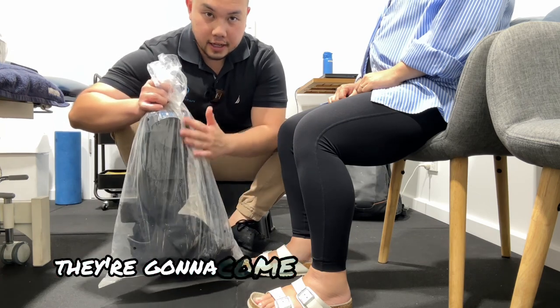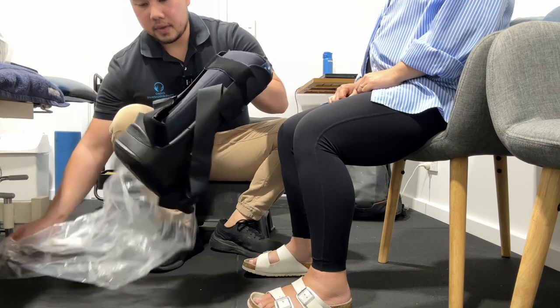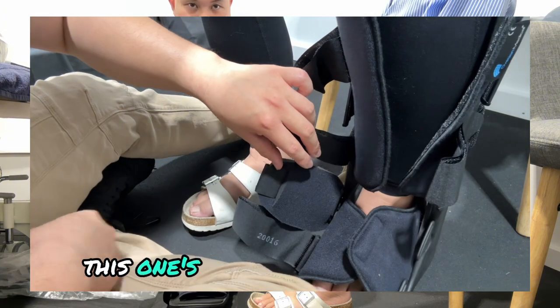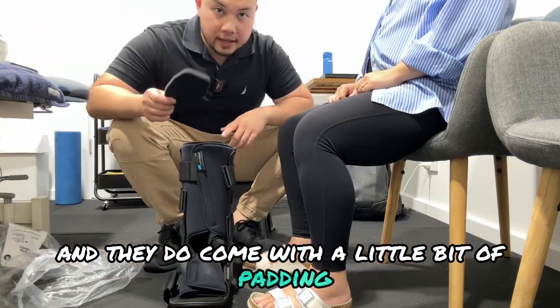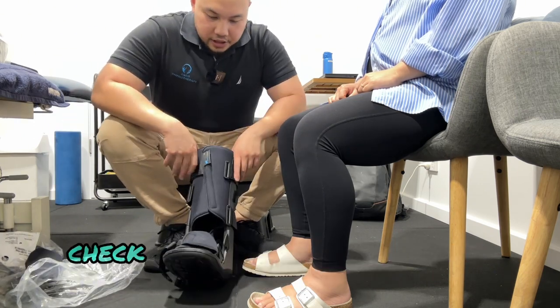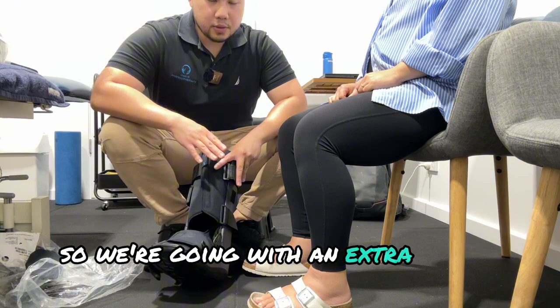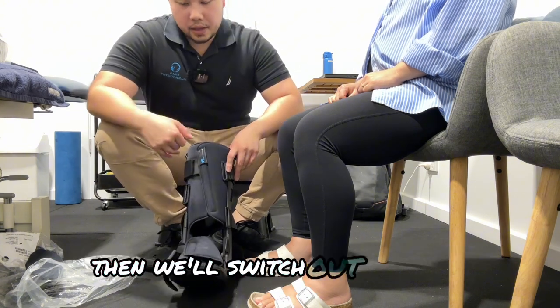Usually when you order moon boots, they're going to come in a bag like this. Most of the boots now come nice and strapped up. This one's one I've opened before and they do come with a little bit of padding — we'll talk about what that is later on. The main thing is check that the size is correct for the person. Our model here has a little bit smaller feet, so we're going with an extra small today. We'll see if it actually fits and if it doesn't then we'll switch out the boot.